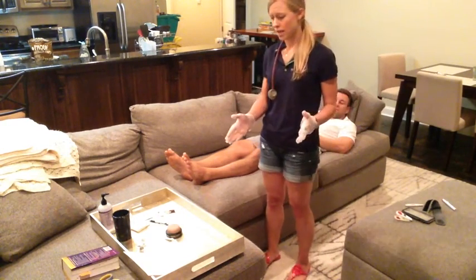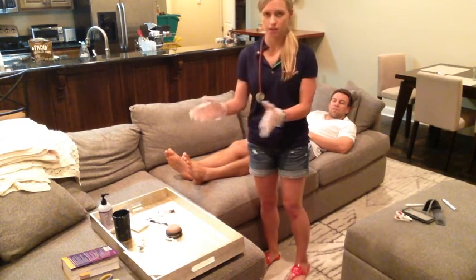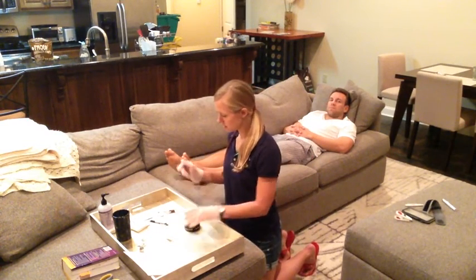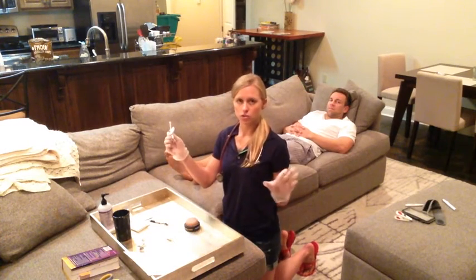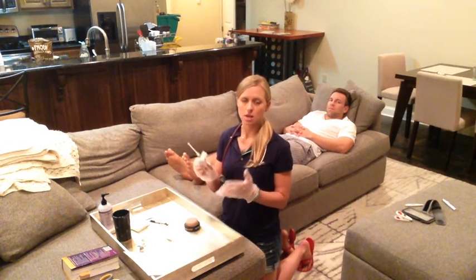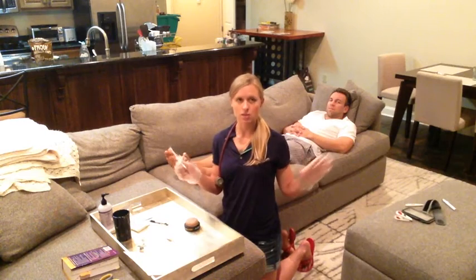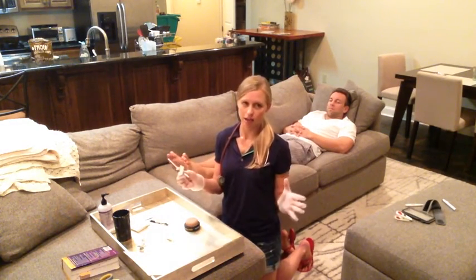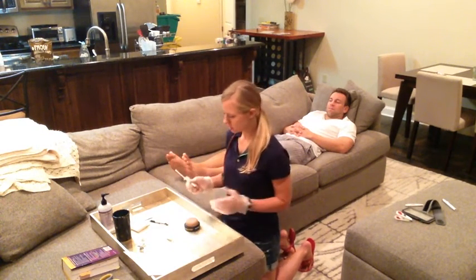Now I'm going to go ahead and show you how to inject the subcutaneous injection of heparin on my handy dandy injection pad. So I have my pad here. We have the needle. Also, just as a note, we did check the patient allergies, we checked the patient name and everything at the beginning of the assessment, and we could check that again just to make sure that it was the correct patient getting the correct medication.